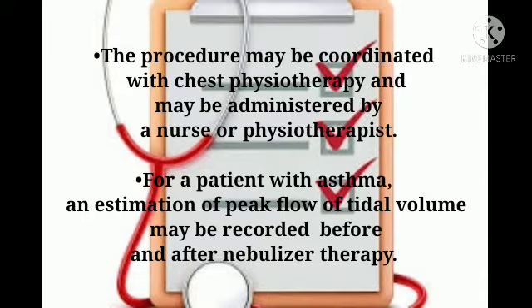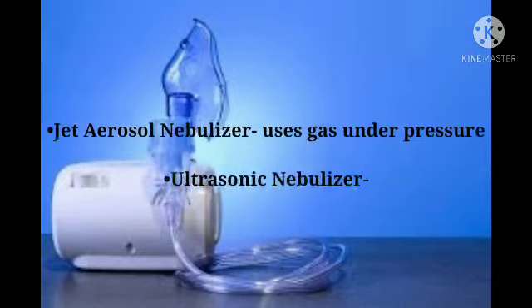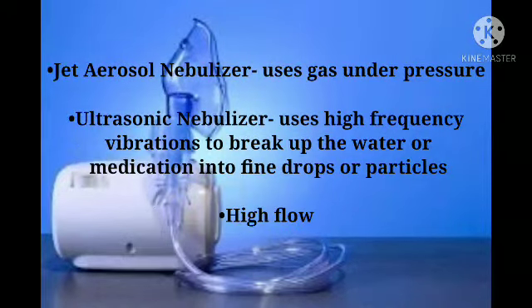nebulizer therapy. Main types of nebulizer. Jet aerosol nebulizer uses gas under pressure. Ultrasonic nebulizer uses high-frequency vibrations to break up the water or particles.